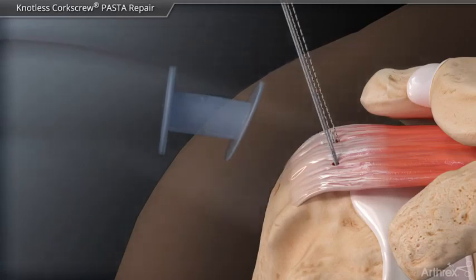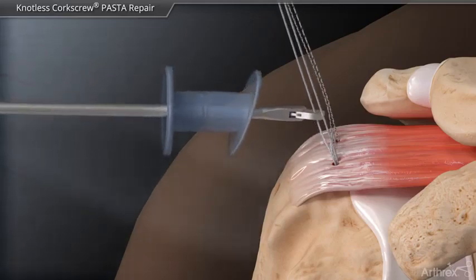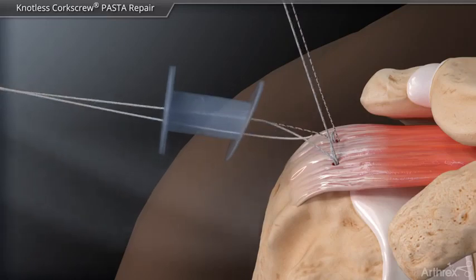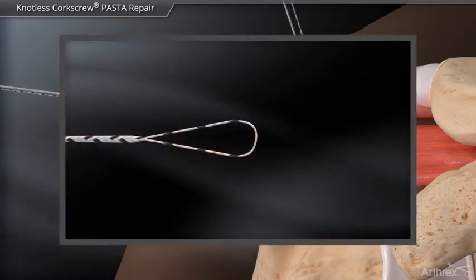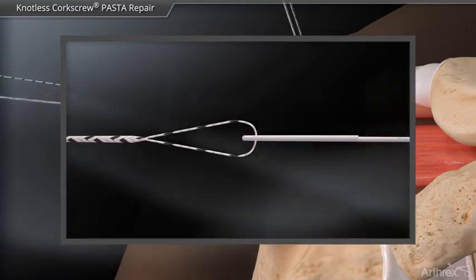Next, the repair suture from the anterior anchor and the looped end of the fiber link from the posterior anchor are retrieved out the lateral portal. Again, the white portion of repair suture is loaded into the loop and shuttled back into the anchor locking mechanism.